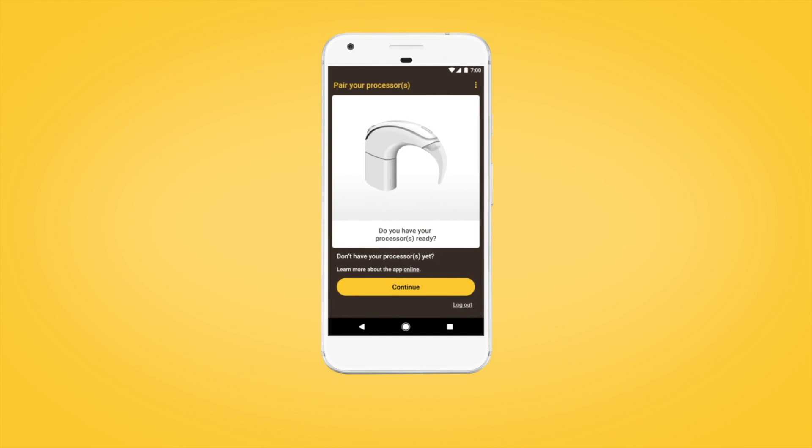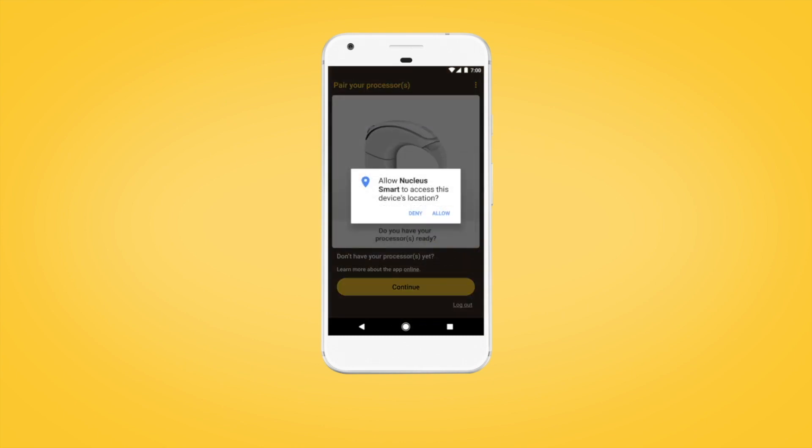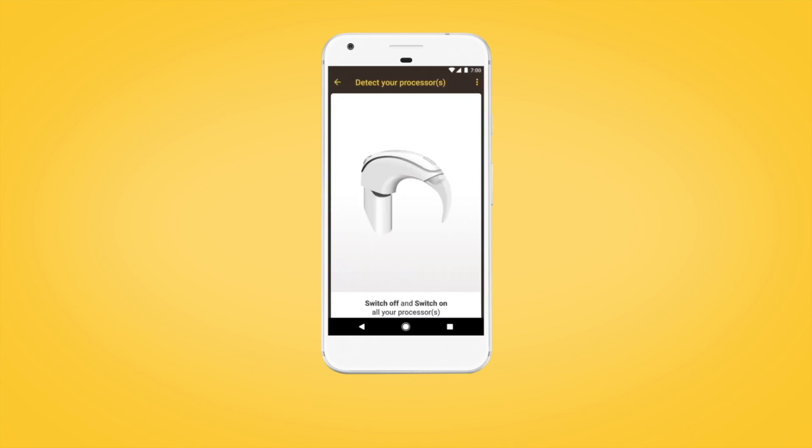When you have your sound processor and are ready to pair, on the Pair Your Processor screen, tap Continue and follow the prompts to allow location access. This enables your Android device to detect your sound processor.